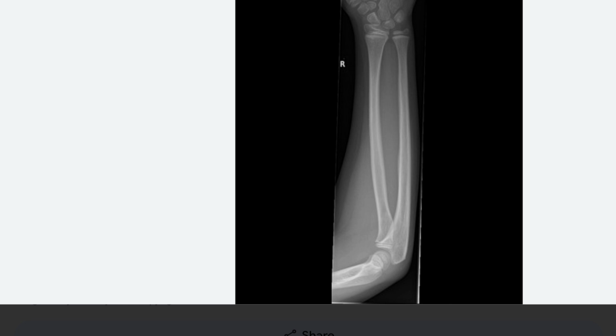Nowadays, litigation and peer pressure do not mandate waiting for so long as investigation like computed tomography, CT scan can reveal it immediately. Two injuries, it is commonplace to find some group of injury together, so it is logical to order radiograph of expected other injury simultaneously.